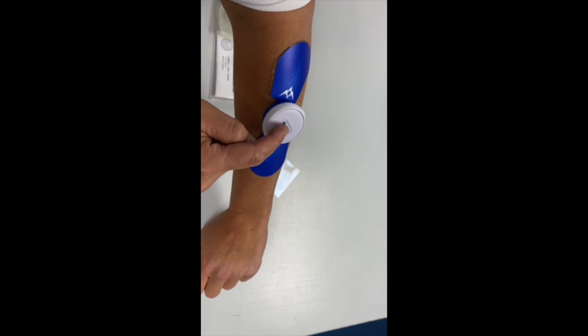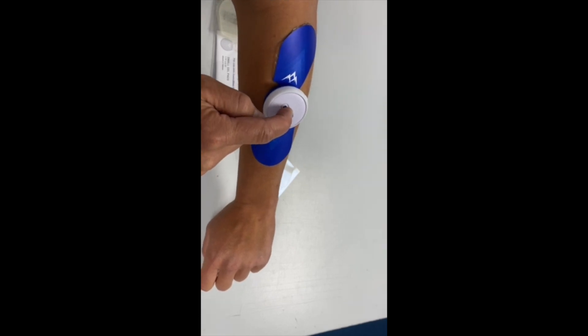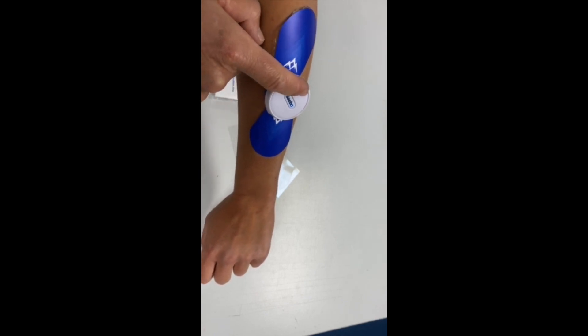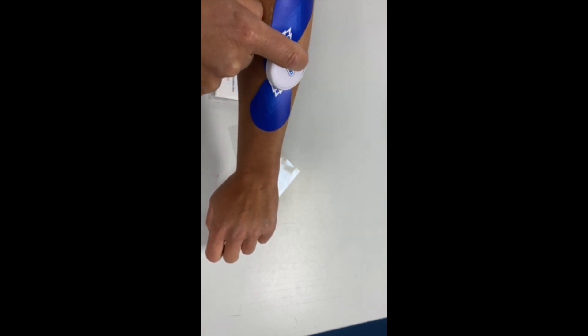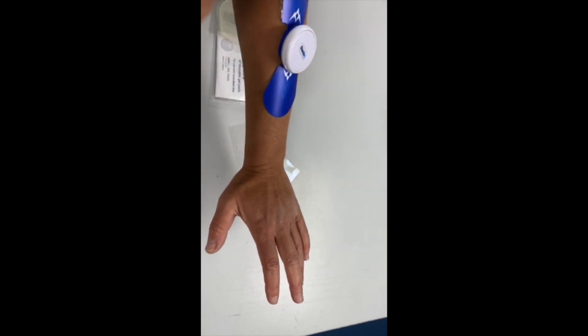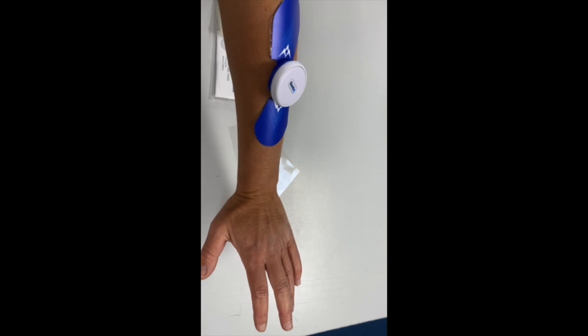You're then going to press and hold the Sabo button for three seconds until you hear a beep and the light in the letter O lights up. You've then got two raised dots to turn up the intensity. And that's your Sabo Stim 1 going.